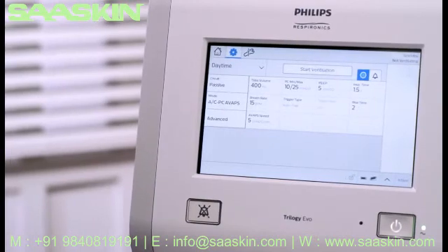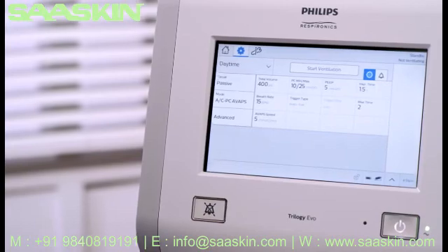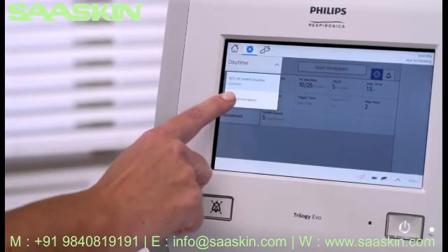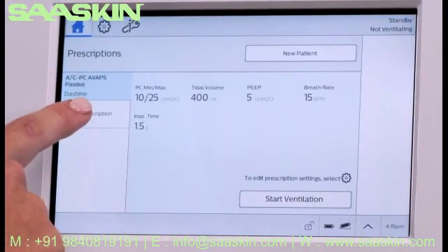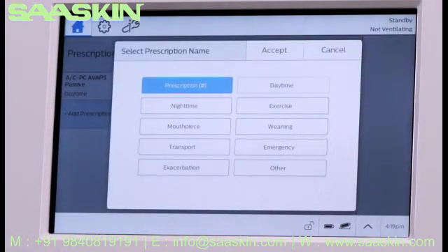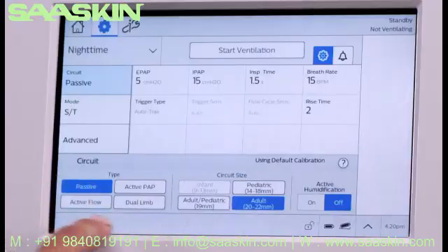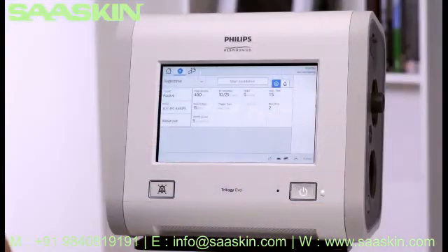Some patients have multiple prescriptions and Trilogy EVO is able to store up to five. You can add additional prescriptions from the Prescription drop-down menu in the Settings window, or go to the Home window when in Standby and tap Add Prescription. Follow the on-screen prompts to choose a prescription name, such as Nighttime, and use Settings to edit them. For this example, we'll make the same changes as before but will turn Active Humidification ON. When all necessary edits have been made, accepted, and the circuit attached.